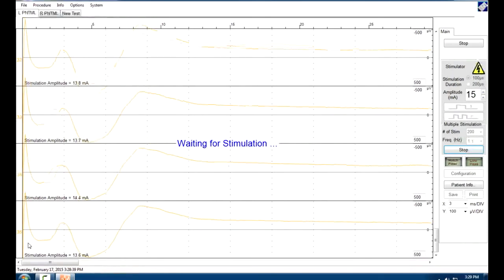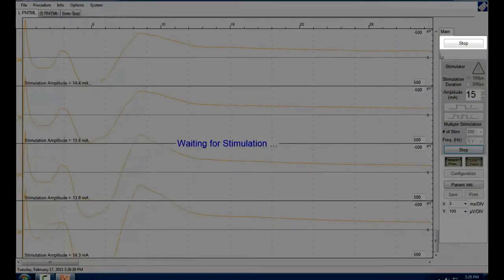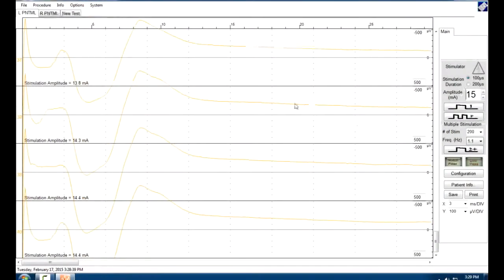And you find two in a row. And I kind of like that right there. So we're going to stop there. There's a stop button up here in the upper right-hand corner.